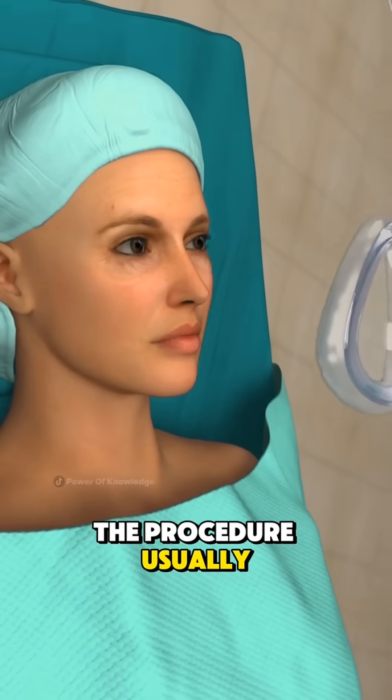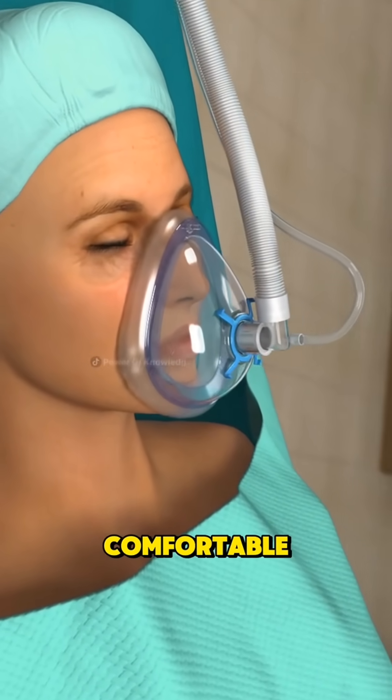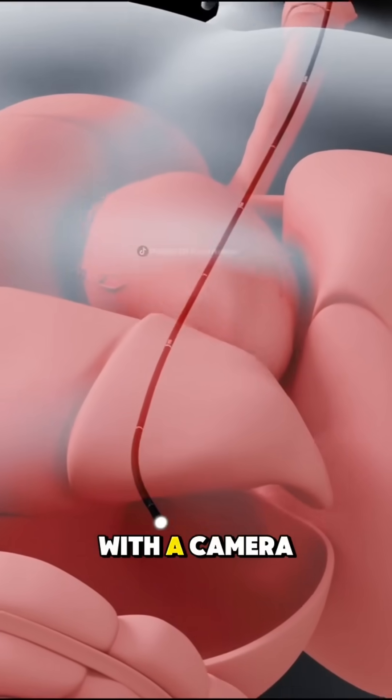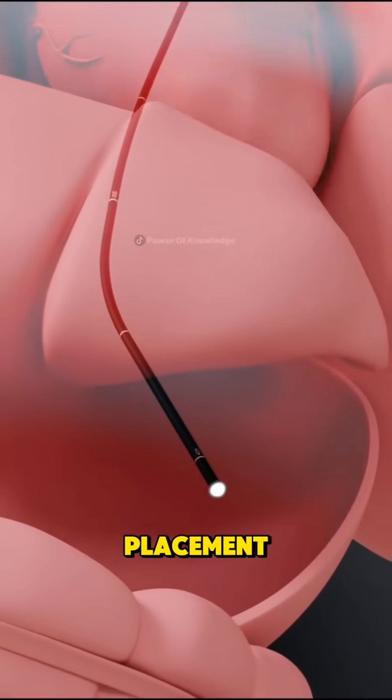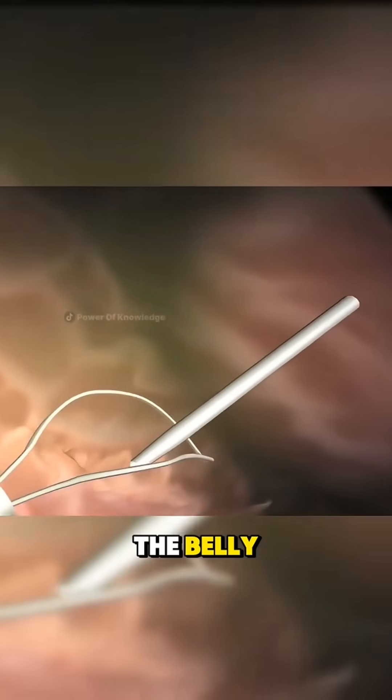The procedure usually starts with giving the patient anesthesia or sedation so they stay comfortable. Then, using an endoscope — a thin tube with a camera — doctors guide the placement from inside the stomach.